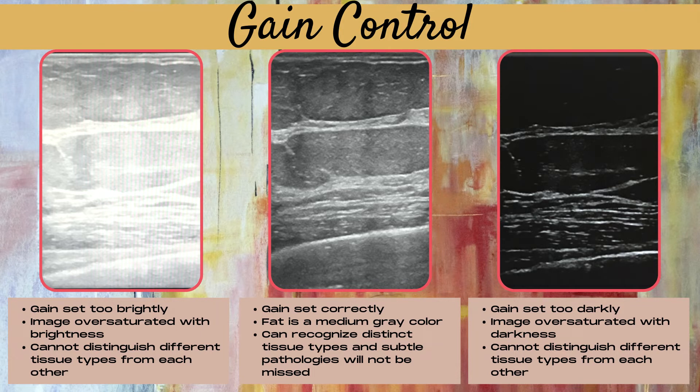On the image on the far right-hand side, the gain is set too darkly and the image is oversaturated with darkness, and you also cannot distinguish different tissue types from each other. In the middle image, the gain control is set correctly. The fat is set to a medium gray color, you can recognize distinct tissue types, and subtle pathologies are not going to be missed when the gain control is set correctly.